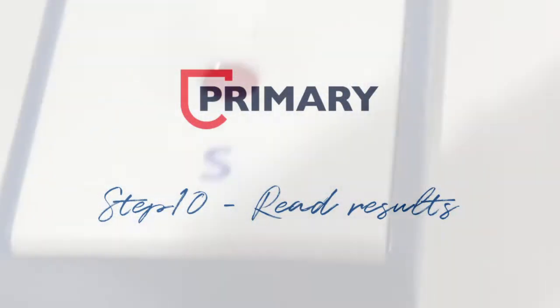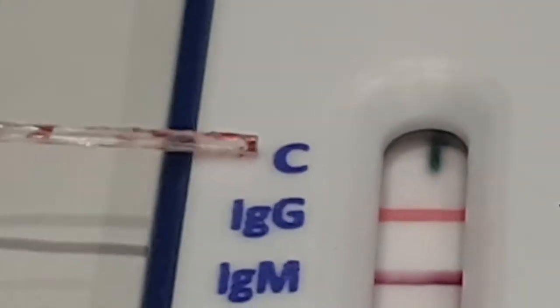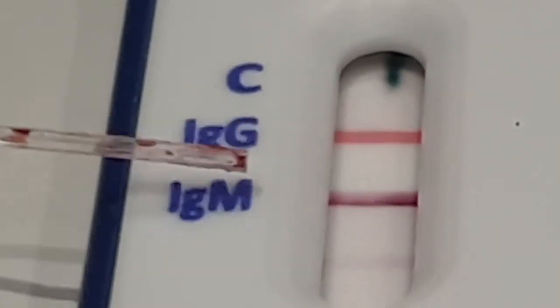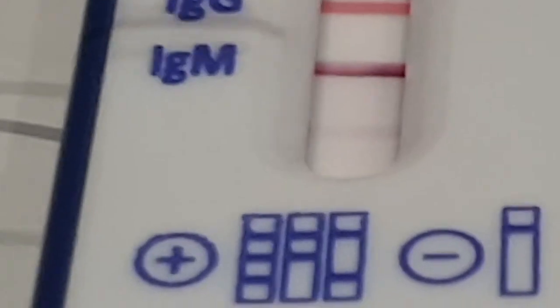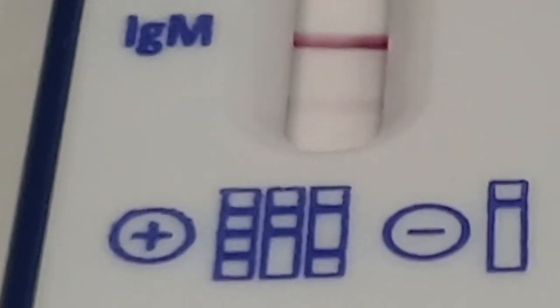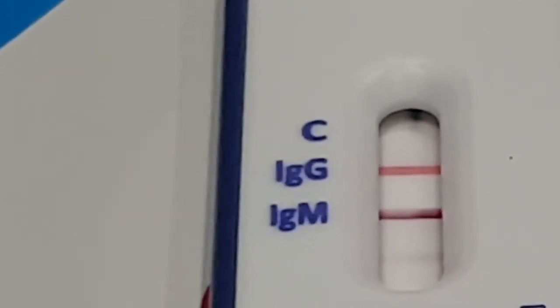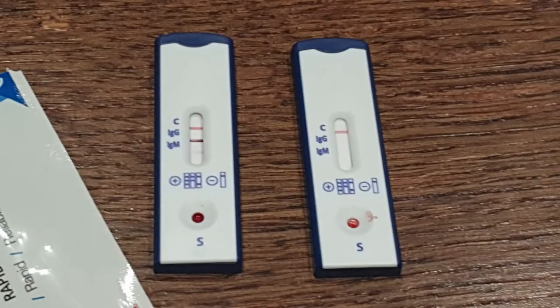Step ten: reading the results. From this sample we can see three bars — two strong top bars and one extremely faint bottom bar. The top bar represents control, proving that the test device works as expected. The middle line shows that the body has recently fought a COVID infection and has a store of antibodies to fight a future infection. The bottom line indicates whether a person is actively fighting the COVID virus.